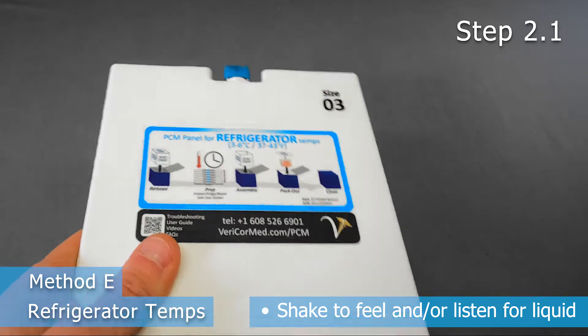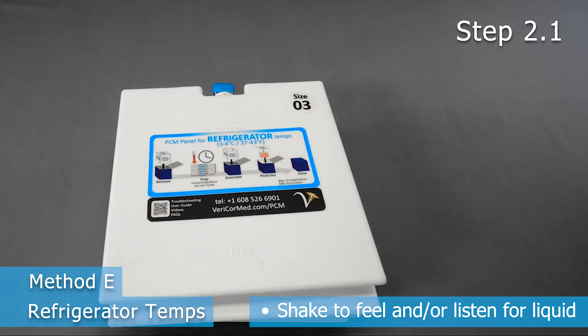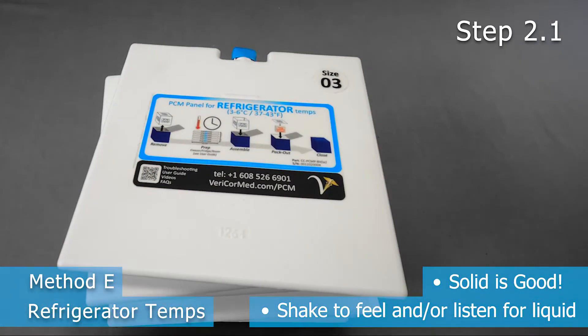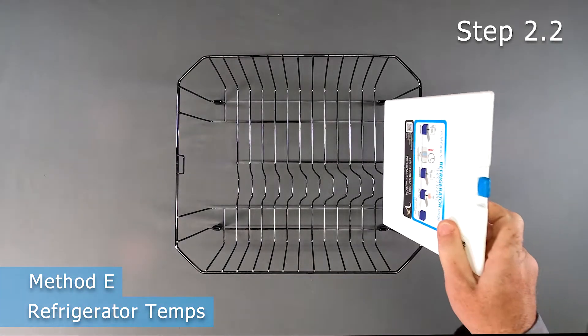When removing panels from the freezer, shake each panel to feel and/or listen for liquid. If there is liquid, continue to freeze as it is not ready. If totally solid, proceed on.